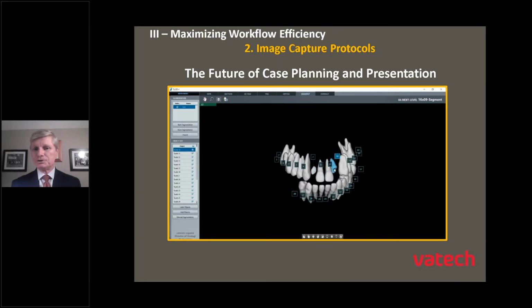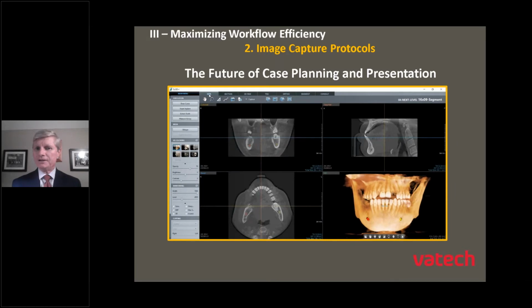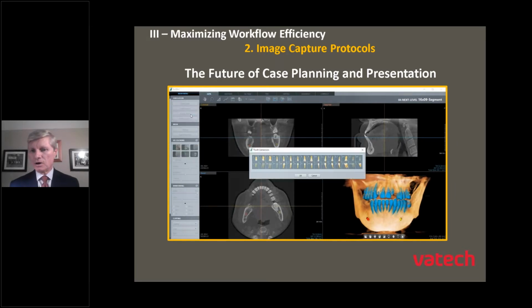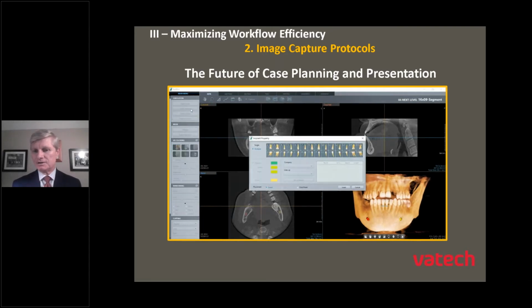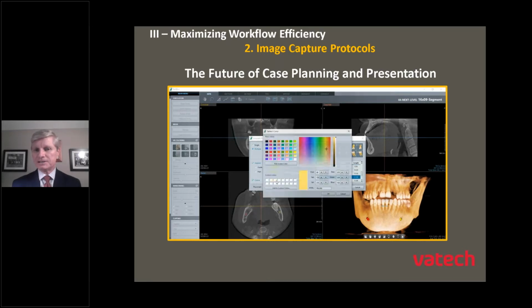This will allow you to quickly segment the entire arc automatically, and then using the tool called Auto or Smart Implant, I can identify my site numbers, like I did in this case for site number 7 and number 10. I did an extraction of those sites of these laterals that were never properly developed. And now I'm going to go ahead and place implants.